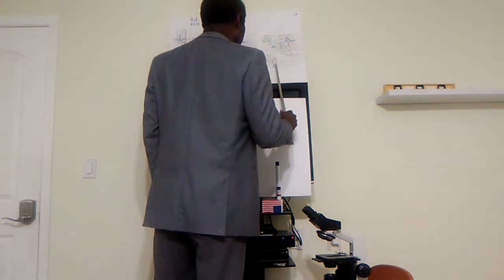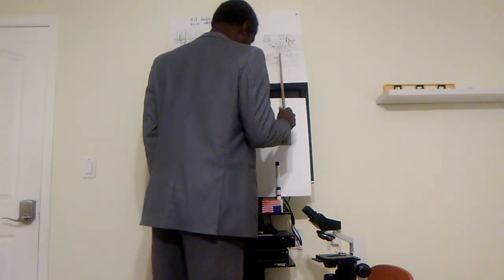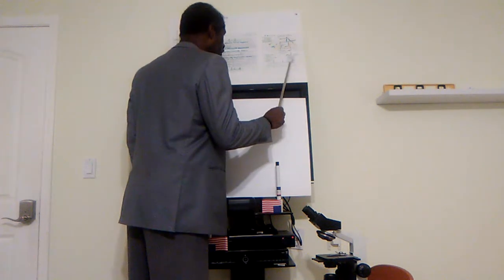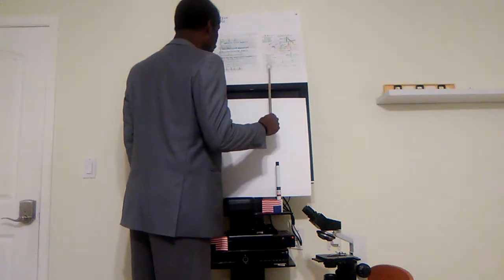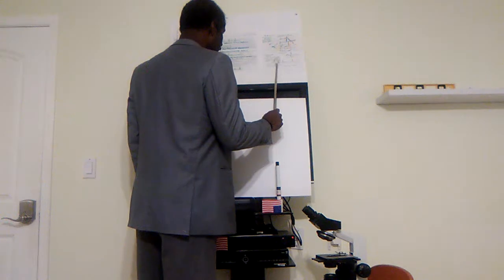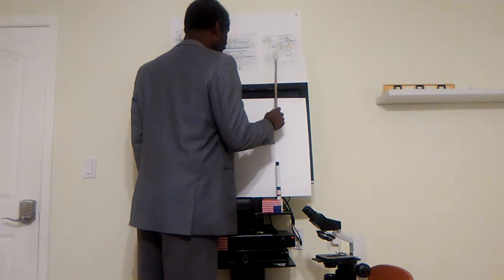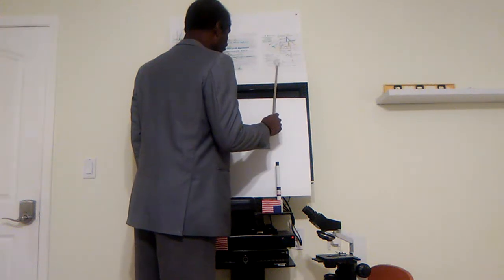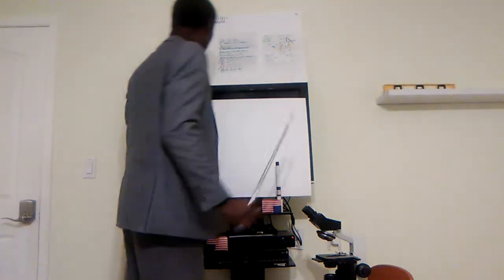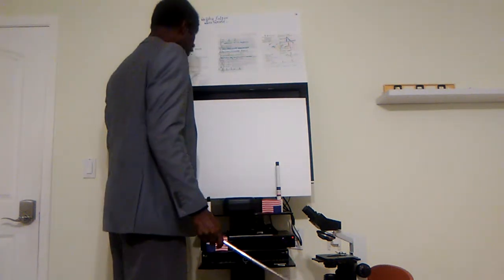And here we have a representation of a normal ECG again. And I don't know if you could see the ST elevation for this one. We could also draw ST depression as well. ST elevation is just up, the amplitude is up on the vertical scale, and ST depression is down.